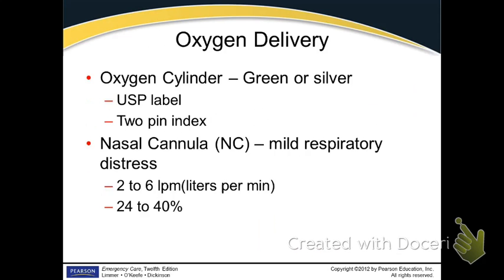This device here is more like what you would see in the hospital. This type regulator here. The nasal cannula, like any delivery device, you're delivering supplemental oxygen. So this is going to aid in breathing. With any medication, you have indications, which would mean that's what it's for, right? Contraindication, which means what? Contra, exactly what it's not for, against. Not too many contraindications for oxygen.